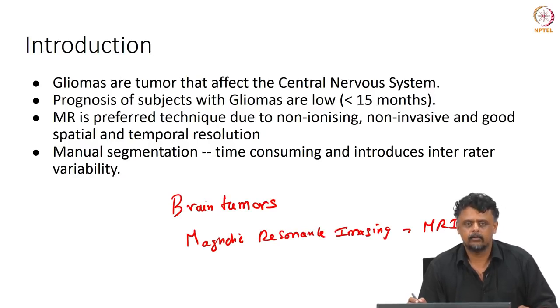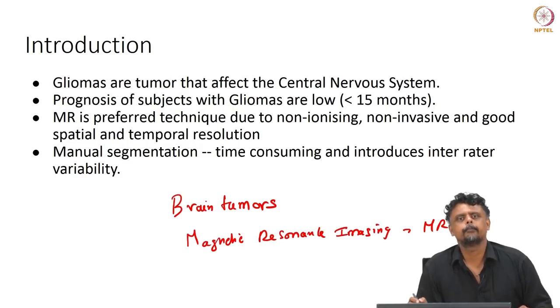So, the segmentation or delineating the pixels corresponding to the tumor is an important diagnostic task. It is typically done manually by an expert radiologist. However, it can be very time consuming, and there is some variability among the radiologists on certain tasks.